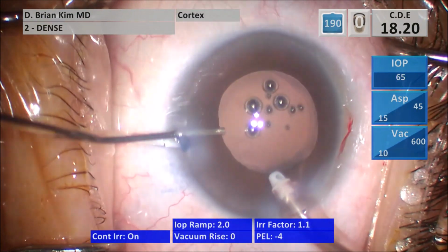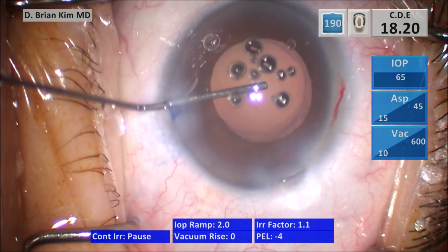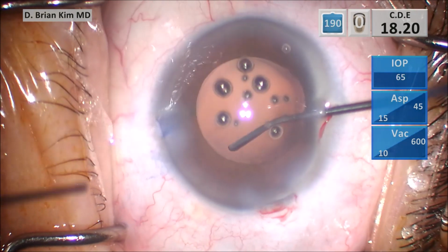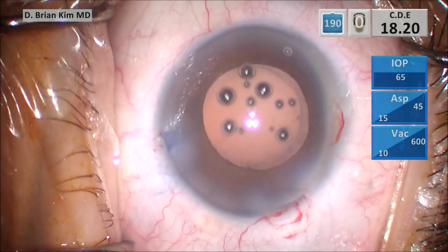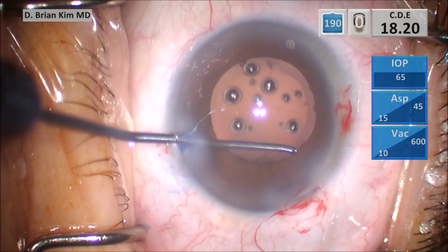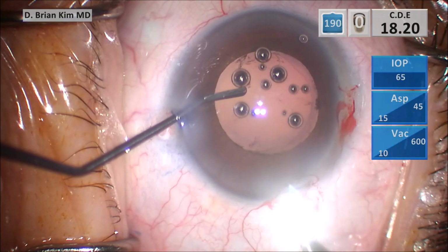So again, I'm pushing cohesive viscoelastic to fill the bag now. And then I'm going to go ahead and polish with the sweep, polishing under the rhexis edge of the lens epithelial cells. You can see the bubbles moved a little bit, and that's because as I filled the eye with the cohesive viscoelastic, it caused the bubbles to move. But those bubbles are still there. They haven't moved throughout the entire case.